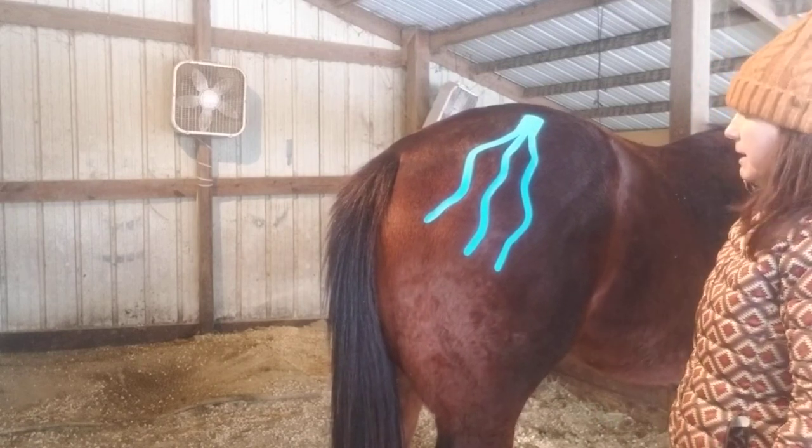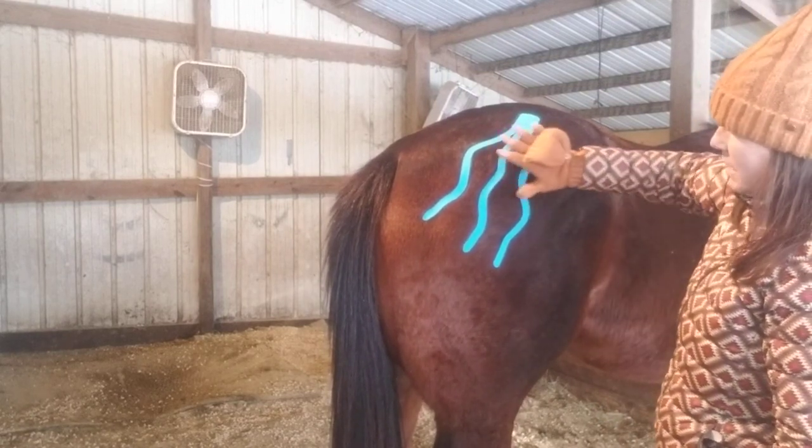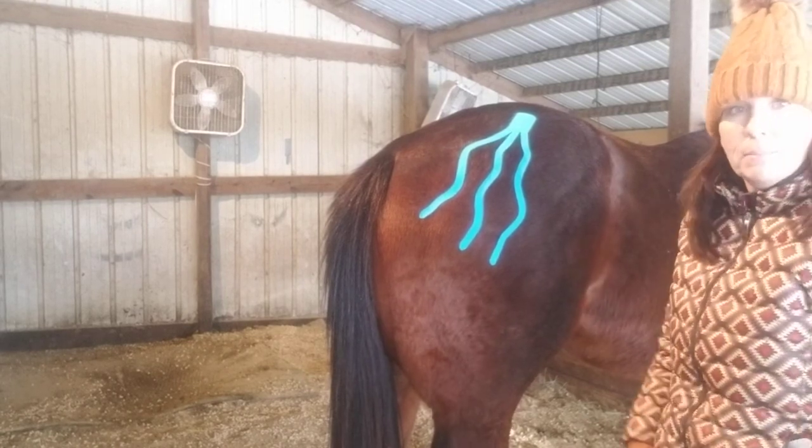So that's my fascia application for the fascia in this area here. That's it, thanks.